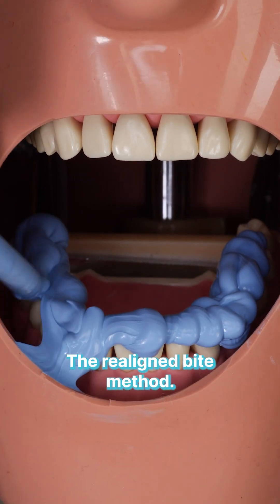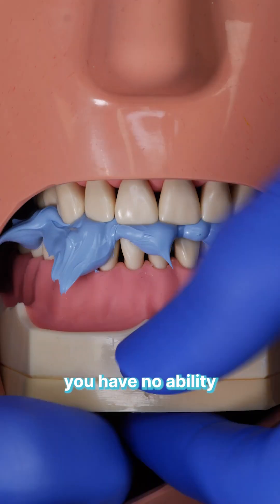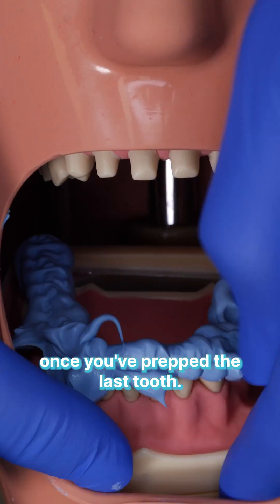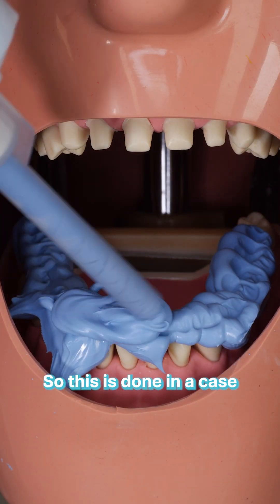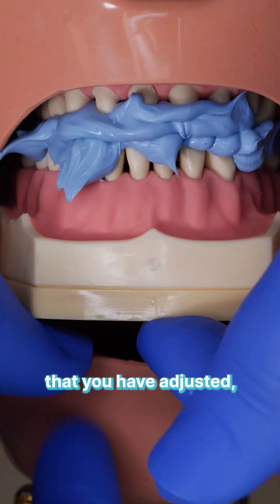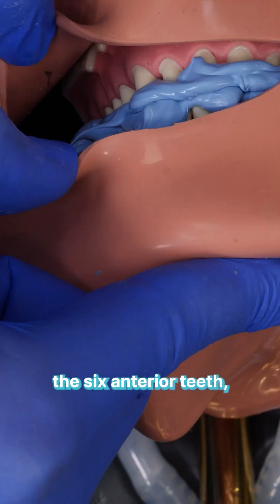The relined bite method. When doing a full arch prep, you need to maintain the bite. Otherwise, you have no ability to know where the jaw sits once you've prepped the last tooth. In this case, a full arch bite record is done before prepping any teeth — specifically when you want to maintain a bite you have adjusted, possibly because the condyles are unstable.